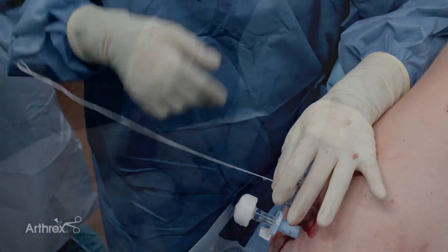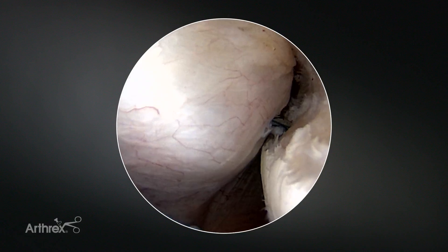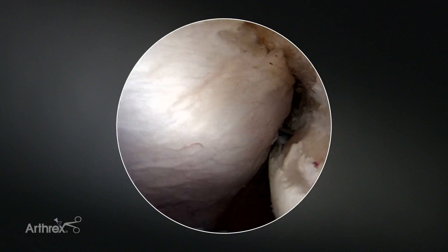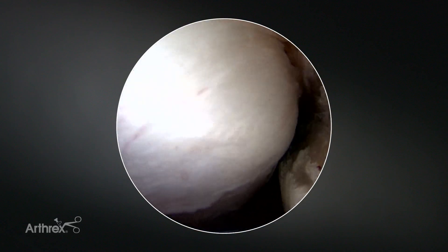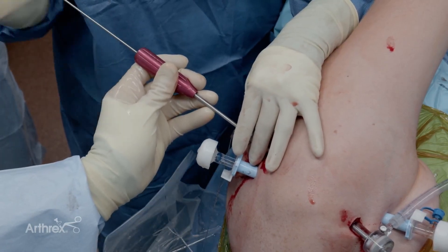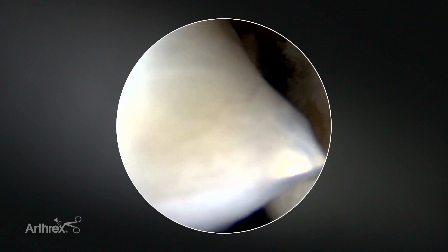I'll remove the guide. Next I'm going to place my superior anchor. I will insert the guide first without the trocar in place — both anchors are going to go through this same cannula. Once I get down to just above the tissue, I'll insert the trocar into place so that I just do not catch the other sutures on my way down. Here we can see the spike just reaching the soft tissue.